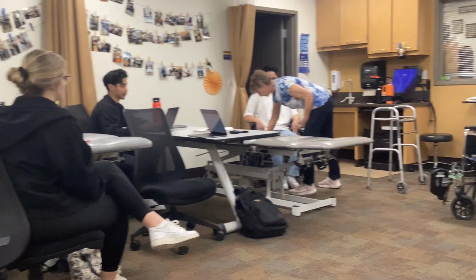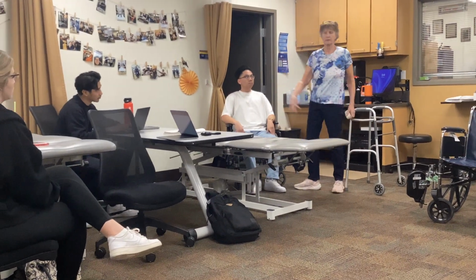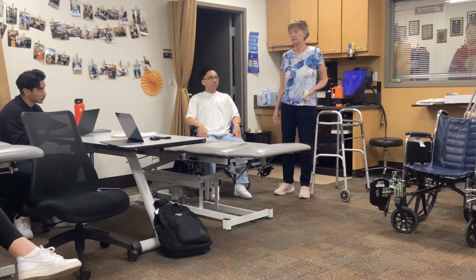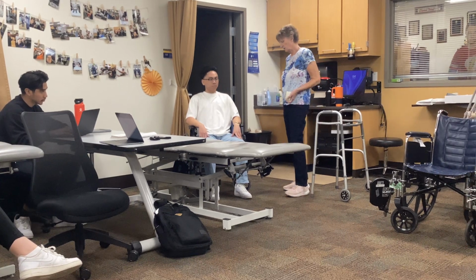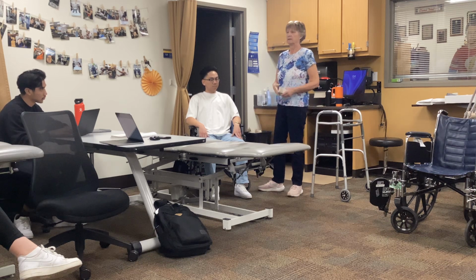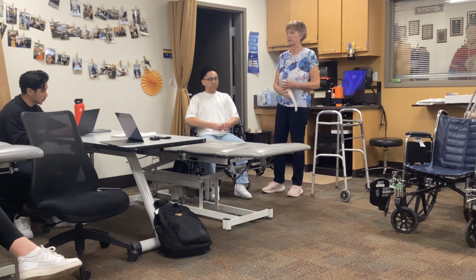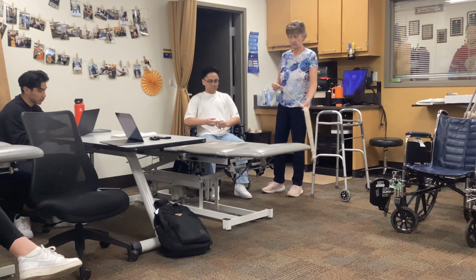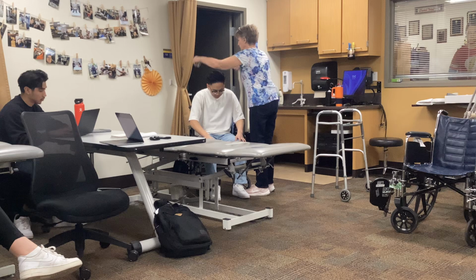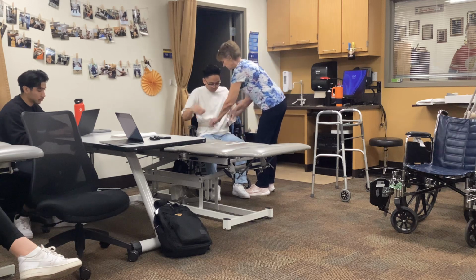You would have a patient ambulate with their assistive device over to the treatment table, mat table, etc., in order to participate in an exercise session. Let's just look at it from the get-go here, in case you're just going to bring them over to the treatment table. So, of course, we have the gait belt on.